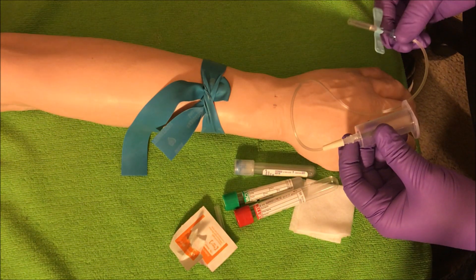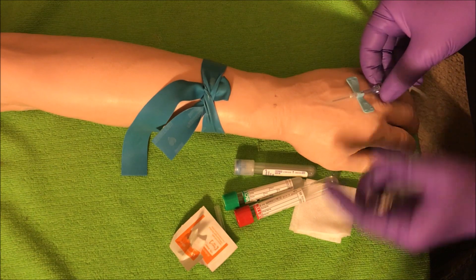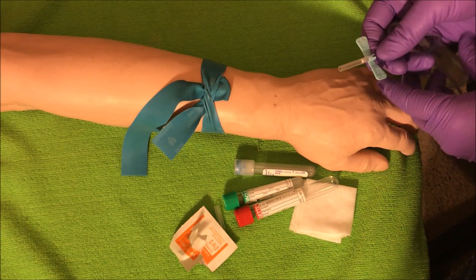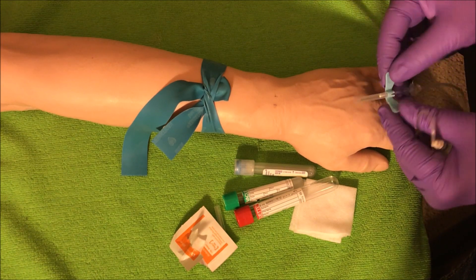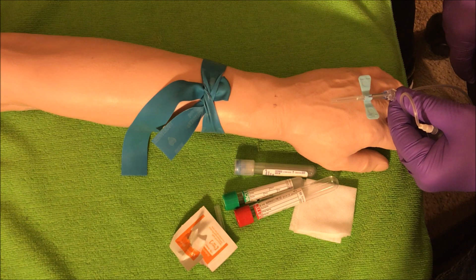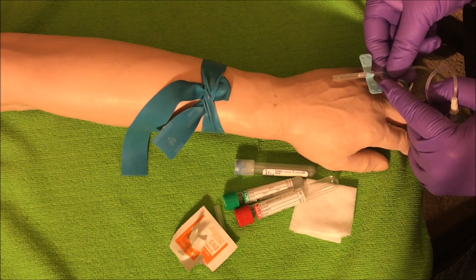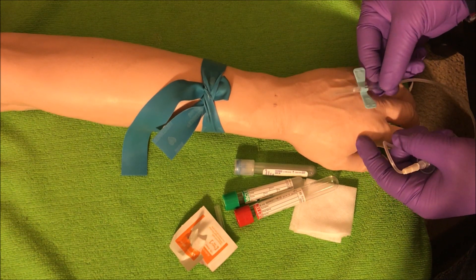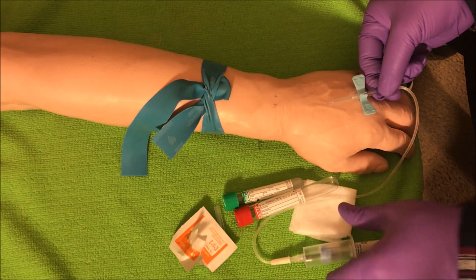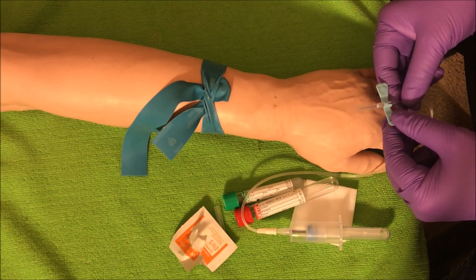With the butterfly, there are different ways to handle the vacutainer holder. I can hold it with one hand, pop the needle in, let go, and get my tubes — or I can put it in my hand and grab it with two fingers. I don't like to hold the butterfly by the wings because when you enter a vein, you'll see a flash of blood right in the tubing — that tells you you're in the vein. If I'm holding the wings, I can't see the flash. So I prefer using two fingers and a thumb toward the back, giving me enough visibility to see the flash. When I'm in, I stop — just like with the straight needle — and then get my tubes.